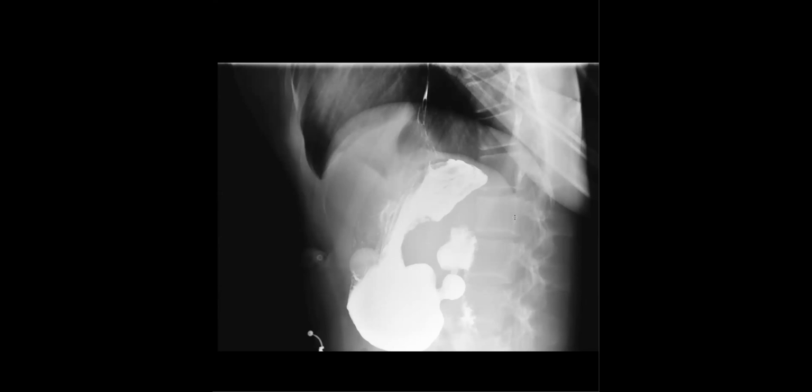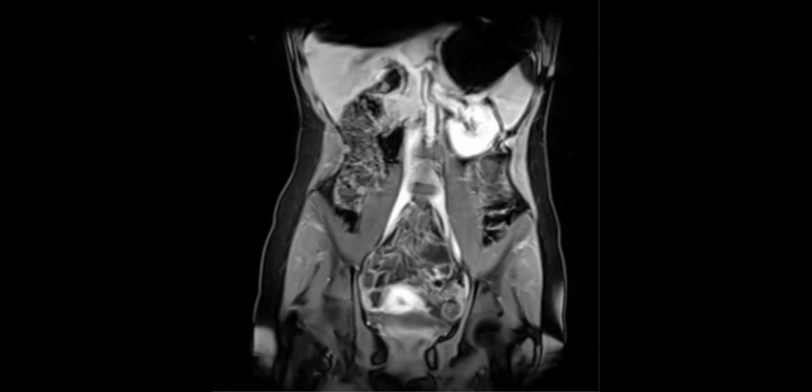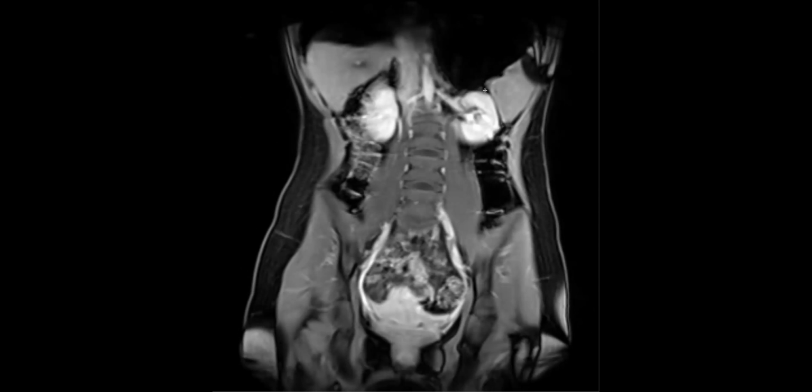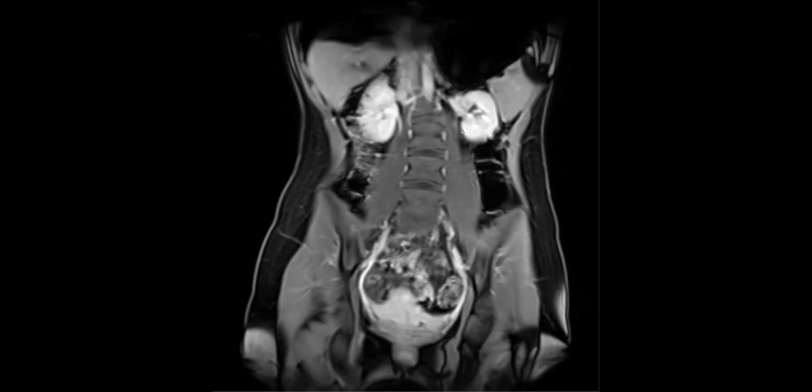So one of the things that I learned from a colleague is, the renal vein also crosses posterior to the SMA. And so patients can also get compression of the renal vein as well. In her case, this is the left renal vein here. The right renal vein is here. So one of the things that we can potentially raise is nutcracker syndrome. But with nutcracker syndrome, my colleague said she would look more for gonadal vein distension, lumbar vein distension, and stuff like that, secondary findings of venous obstruction. And I didn't really quite appreciate that on this patient. So I let that go.